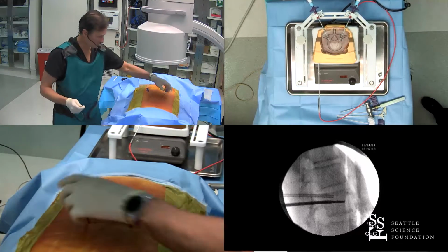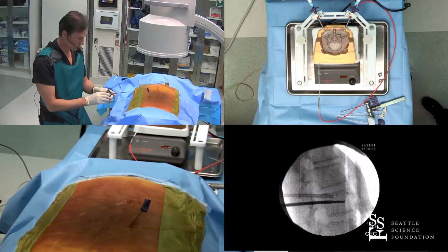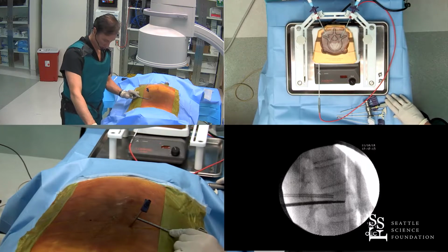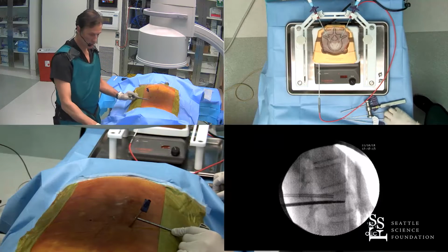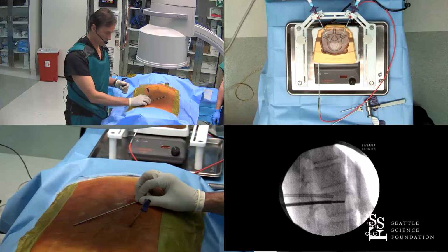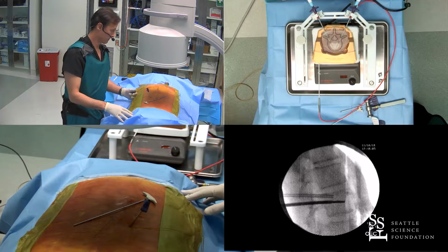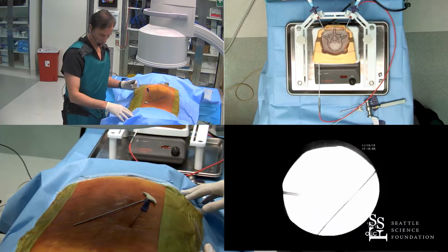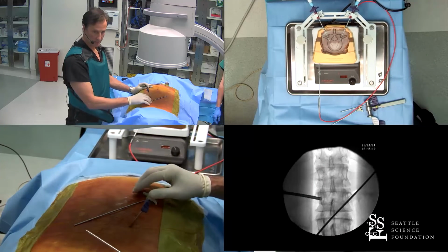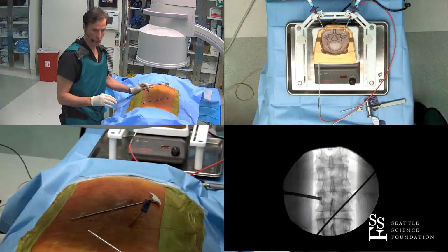I'm going to steal one of the cannulas to demonstrate. I'll reaccess that when we are ready to do some ballooning and cementing. So I'm going to show you a different approach. So peripedicular access. And when do you find you use the peripedicular process? So peripedicular access is fast. It accesses at the body, come inferior just a little bit. Body pedicle junction.